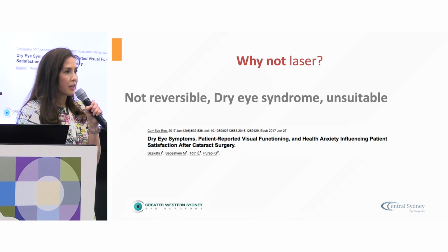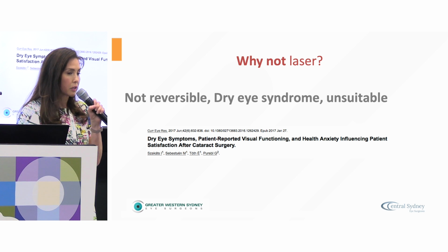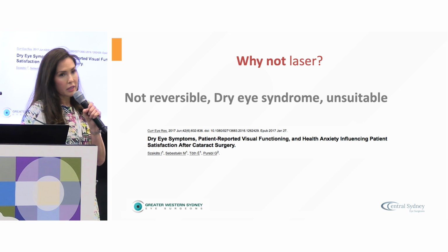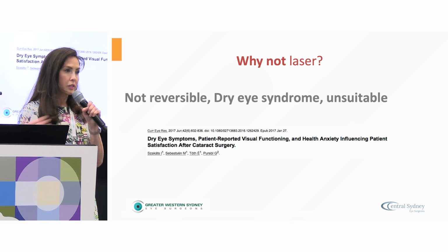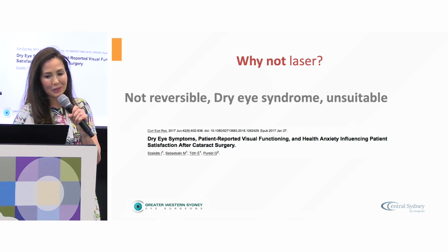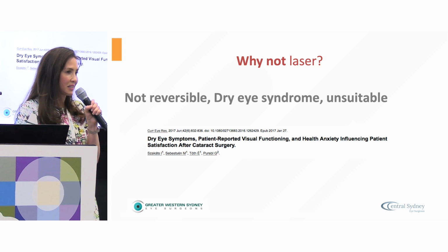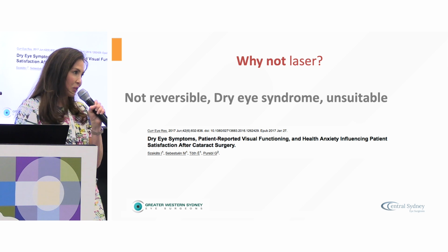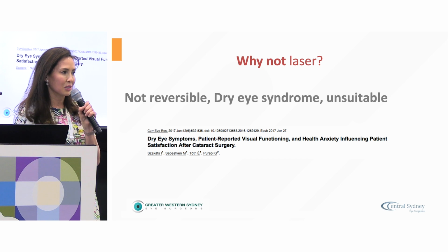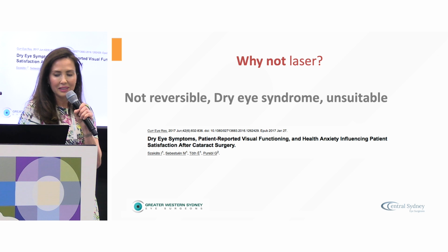So if we want to enhance these patients and bring them back to emmetropia or whatever their target was, then why not perform laser? Not everybody has access to a laser suite. You can send them to me if you want to, but I want you to also be able to do it. And unfortunately, I see a lot of patients with ocular surface disease, and that takes a lot of chair time. So let's try and avoid operating on patients who already have dry eye or inducing further ocular surface disease with a laser.